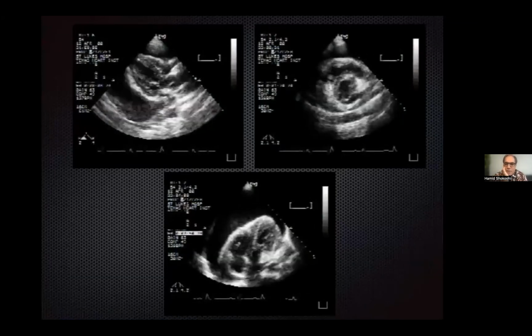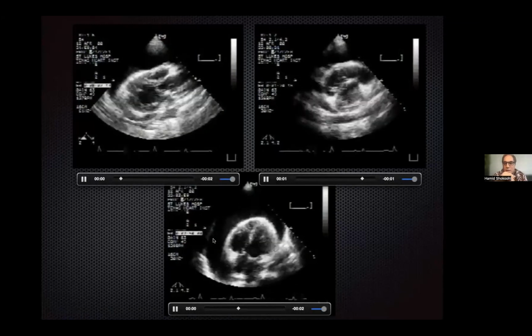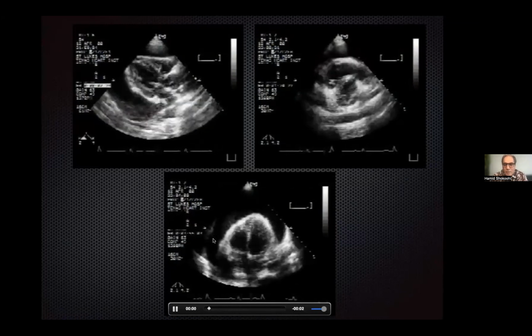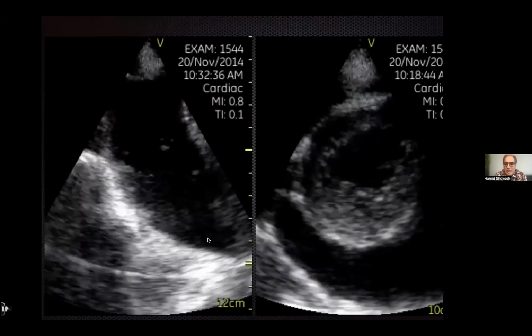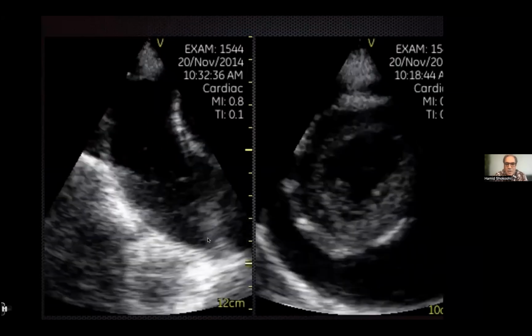This is all different to see. That's one, like the bottom part. You see how much fluid is accumulated here, but this patient does not necessarily have tamponade. The reason is that pressure matters, not the volume. What you see right now is a picture of one of the cases, I think from Malawi. All I see is a super enlarged, global pericardial effusion around the heart. You put the probe on, the one that we had at the time. This is like a V-scan, and you see a large effusion around the heart, and the patient is in shock.